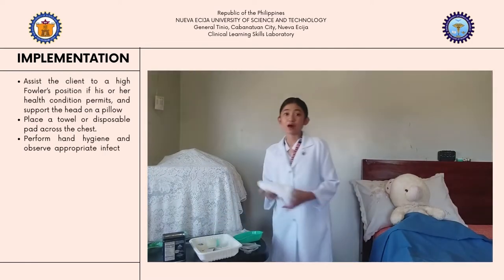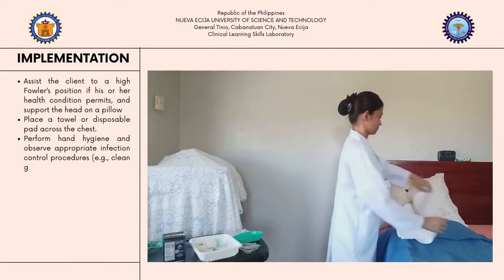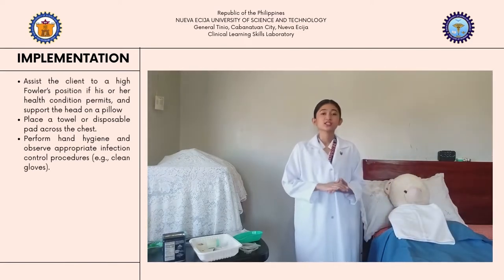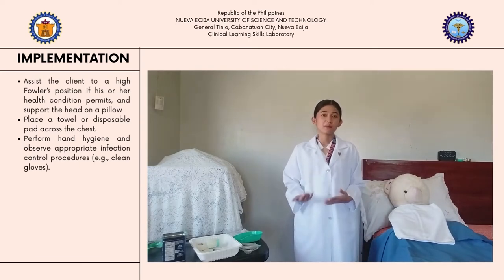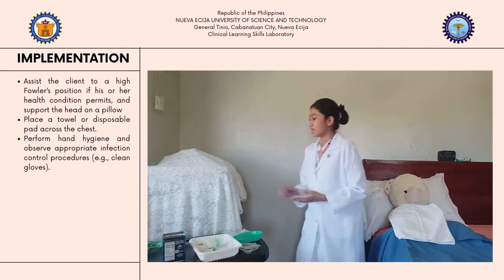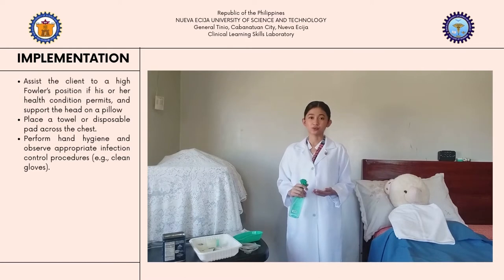Then, place a towel or a disposable pad across the client's chest. This will help protect the client's clothing just in case the client vomits or there are any secretions from the client's nose. Then, perform hand hygiene and observe other infection control procedures.